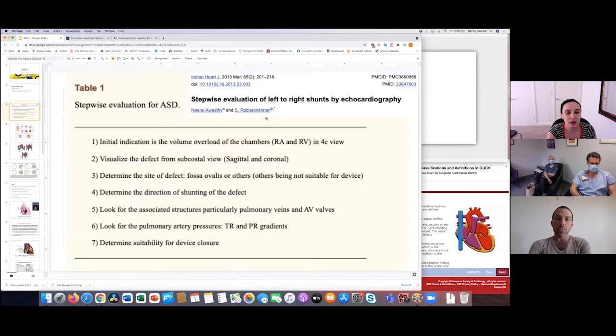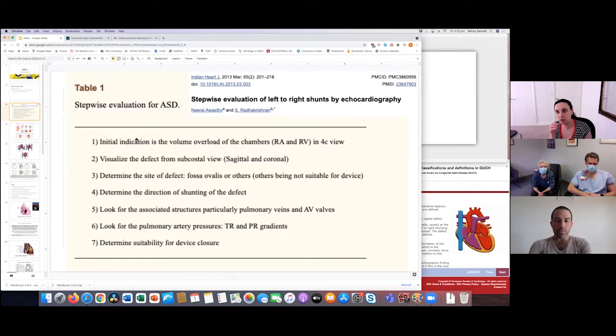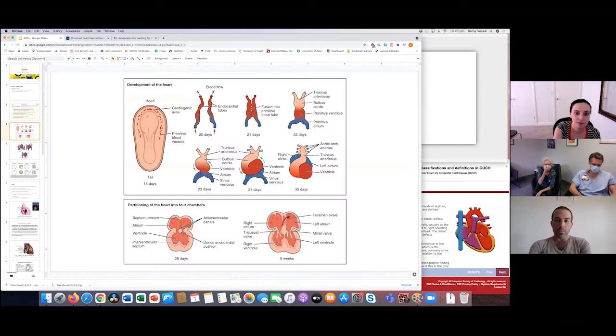There's a little paper that details the steps quite nicely about what you should be looking for in the sequence of your thinking when doing an echo. You see right heart enlargement, then go looking for the ASD, determine size, the shunt direction, look for associated features - I'll list the common associated features with each ASD in a minute - and then determine suitability for device closure.